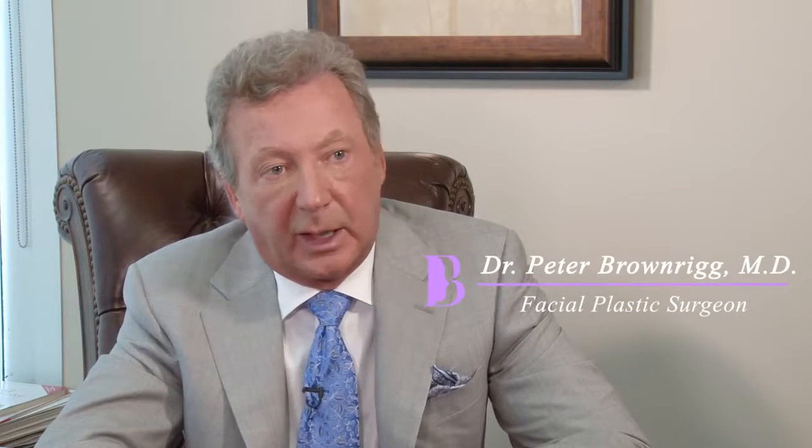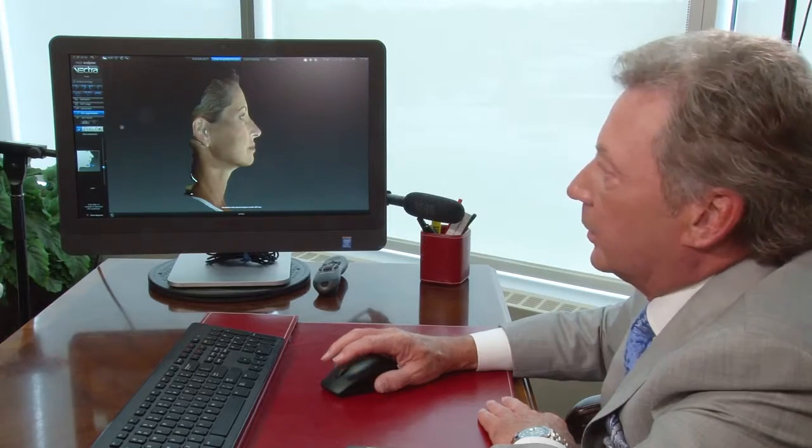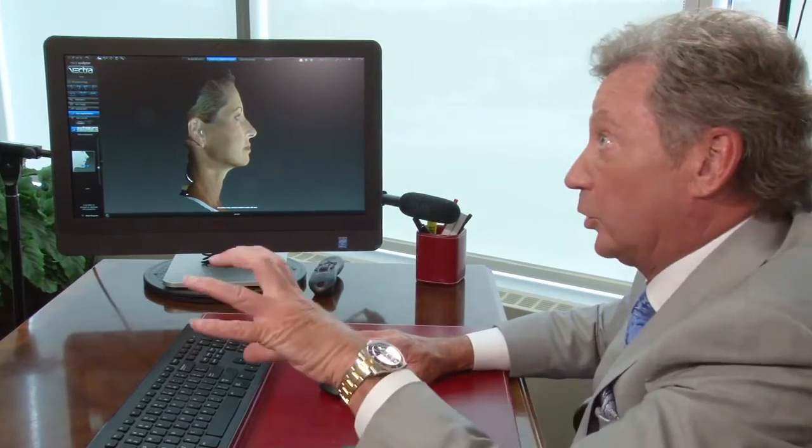The 3D Vectra system is a camera system where I'm able to take photographs and turn it into a 3D picture. Then we can modify that to show a patient what we can achieve. In fact, we now have the ability to take the 3D image and use a printer to print off their face — an actual life-size model.